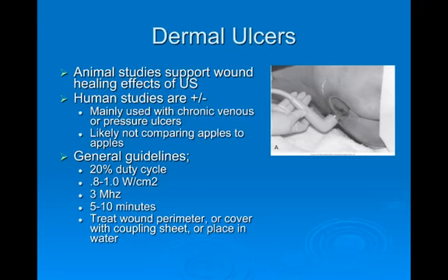The general guidelines for using this for wound healing are using the pulsed protocol, 20% duty cycle, 0.8 to 1.0 watt per square centimeter, using 3 megahertz. Okay, treating the wound perimeter using either a coupling sheet. If it's a foot or ankle, you can possibly place it in water, but usually treating the wound perimeter.